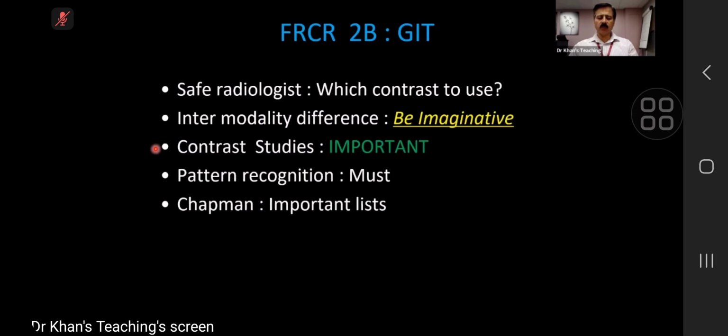Wherever I go in the world, I ask everybody, and contrast studies for obvious reasons have gone down. So it's a weak link for you, and the examiners know it. So contrast studies are still asked in the exam, and I am going to show you a lot of contrast studies intentionally. You are very good in CT, but you are not good in contrast, so I will concentrate there.